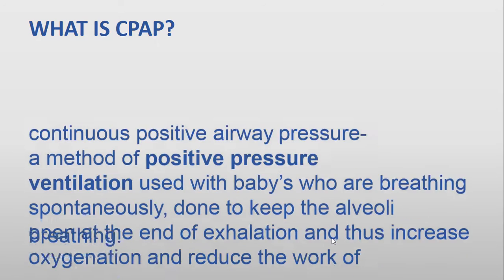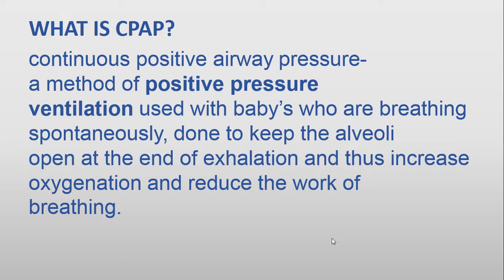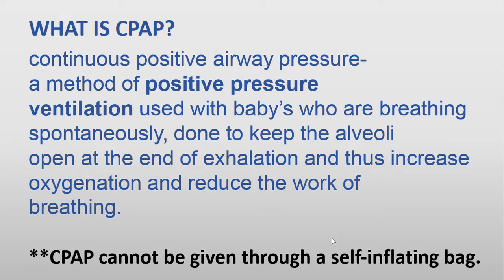So what is CPAP? CPAP is continuous positive airway pressure. It is a method of PPV that's used for the babies who are breathing spontaneously. It's done to keep the alveoli open at the end of the exhalation and thus increases the oxygenation and reduces the workload of breathing on the baby. Again, CPAP cannot be given with a self-inflating bag. We will need to use one of the flow inflating bags that we've already gone over.